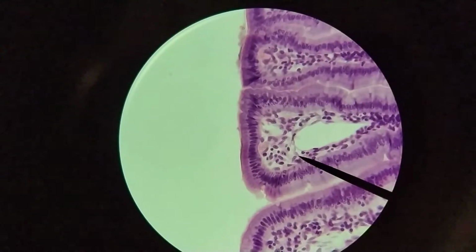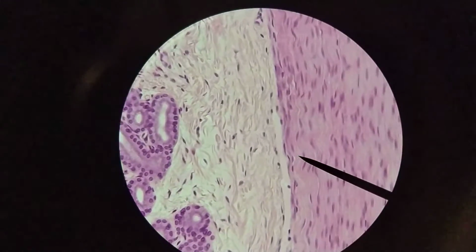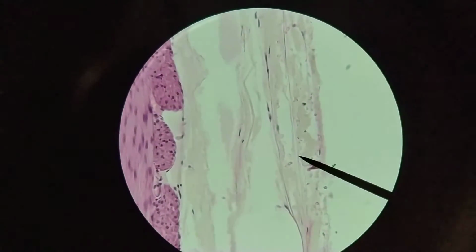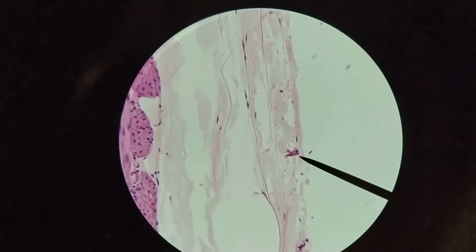Okay, so again, we have epithelium, lamina propria, muscularis mucosa, tunica submucosa with the Brunner's glands, and then we have smooth muscle, an inner circular layer of smooth muscle, and an outer longitudinal layer of smooth muscle. So these two layers of smooth muscle, that's the tunica muscularis, and then on the outside we have a tunica serosa. So on the surface we're going to have a simple squamous epithelium that covers all of this.